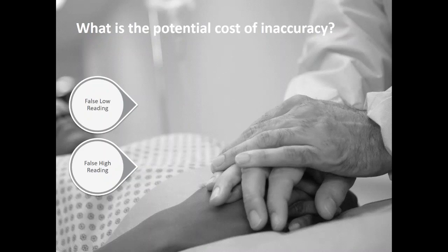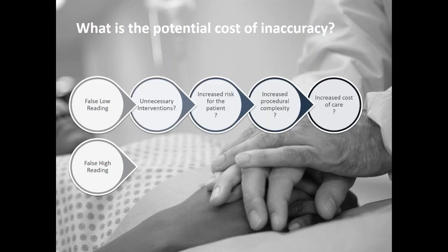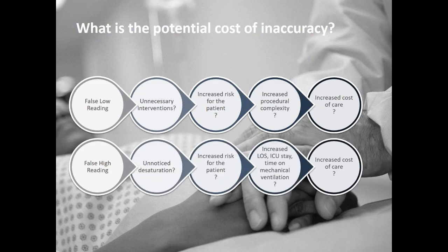And for those of you in the audience that don't use oximetry, I'll put a plug in to consider doing it, because if you're not using oximetry, you're not even aware that the problems are occurring. And for those of you that are using other oximeters and you find that they don't correlate with what's happening from a clinical standpoint, you should consider changing to one that has more accuracy, because if you're getting false information, you're going to do things like we were doing, which is giving blood unnecessarily, for example. And so the cost of inaccuracy can sometimes be worse than not using it at all.